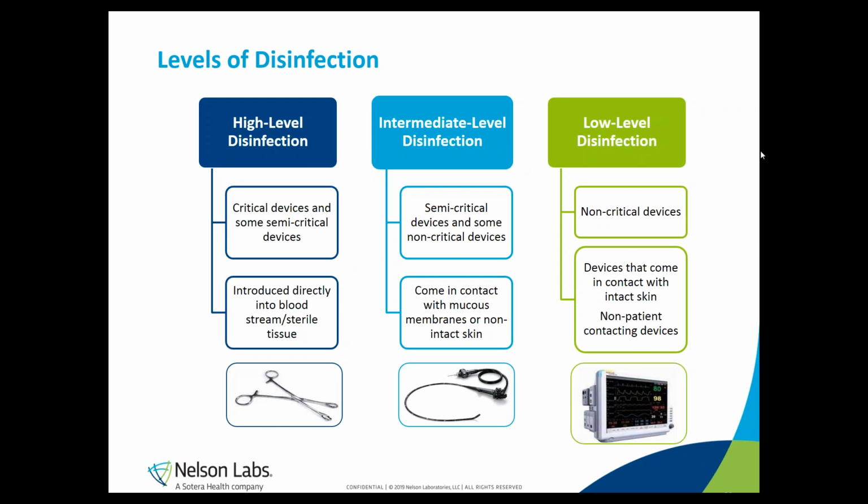First of all, we have the non-critical devices. These are devices that are either non-patient contacting devices or devices that come into direct contact with the intact skin of the patient. Use of these devices carries relatively little risk of transmitting an infection directly to patients, but still can be a source of microbial transmission.